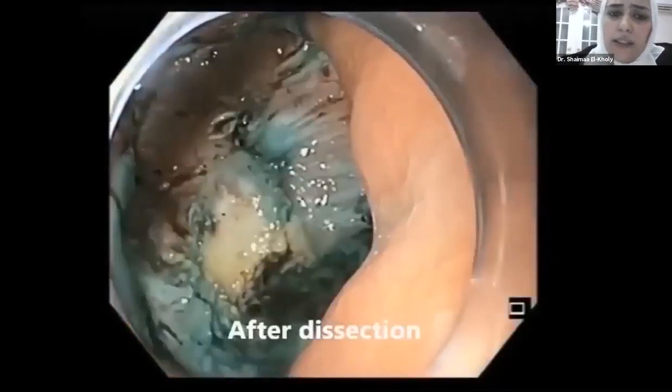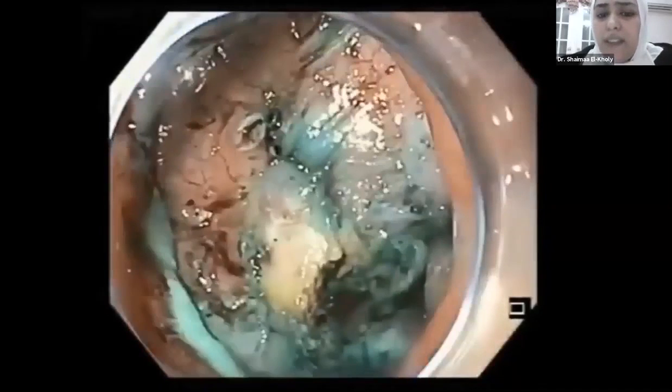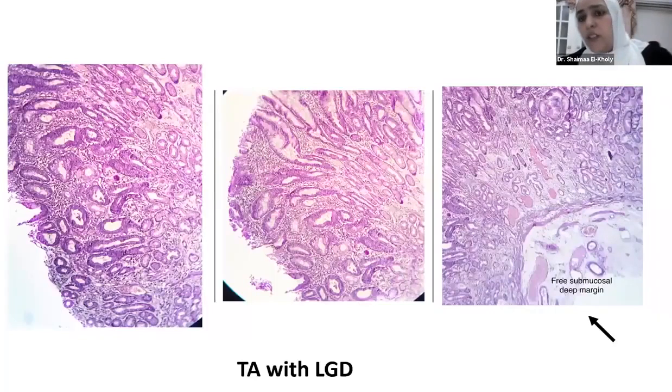At the end of the dissection, you can see that we have dissected the lesion completely. And this area in the middle is just submucosal fibrosis from the previous trial of resection. And here is the lesion. The lesion was shown to be completely benign. It's a tubular adenoma with low-grade dysplasia. And of course, it has a free margin.